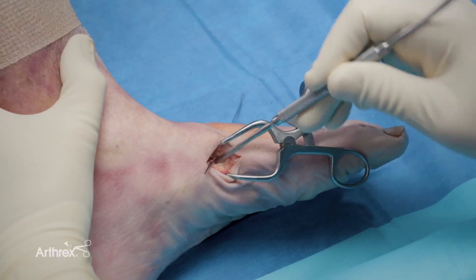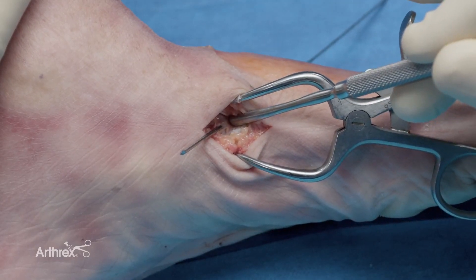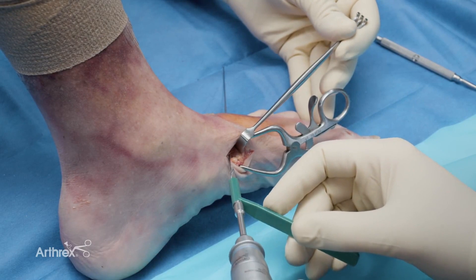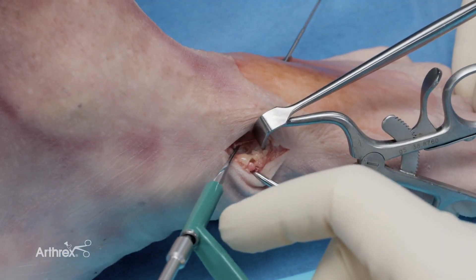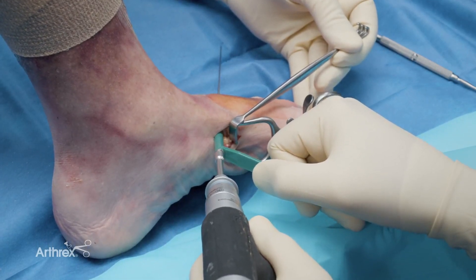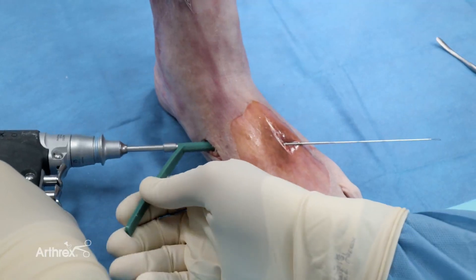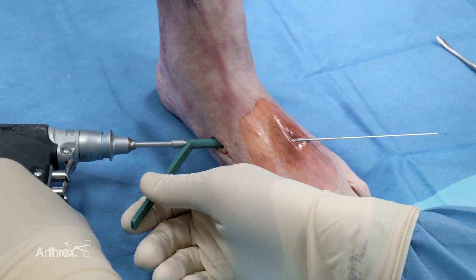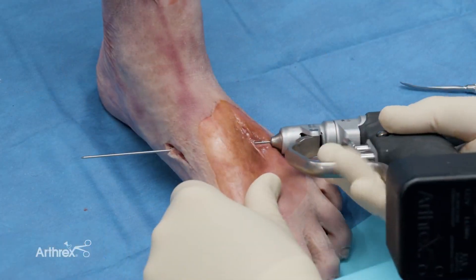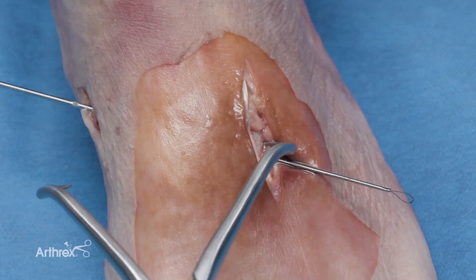I will retract the tibialis anterior tendon and elevate it up, exposing the medial cuneiform. I'll have my assistant hold this tendon while I place my drill. With the tibialis anterior tendon retracted, I now can safely drill the 15-millimeter hole into the medial cuneiform. You can see on the fluoroscopic image that the drill doesn't even come close to the joint surface, knowing that you're going to be safe with placement of your swivel lock. I then advance the wire and place my clamp again.